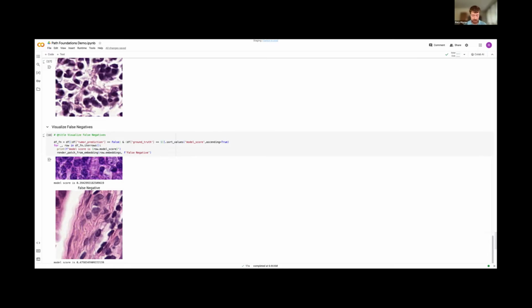Yeah, of course. So a linear classifier, if you think about there's 384 numbers, right? And so when we have a linear classifier, we assign a weight to each of those numbers. So we'll say this particular position 0, right, of the 384 positions, this one we think is really important. So maybe we give that a high weight and say if this number comes out high, we think that's very correlated with whatever thing we're finding, in this case, tumor. And then say feature number 5, we think actually if this is high, it's very uncorrelated. And so that may have a negative weight.